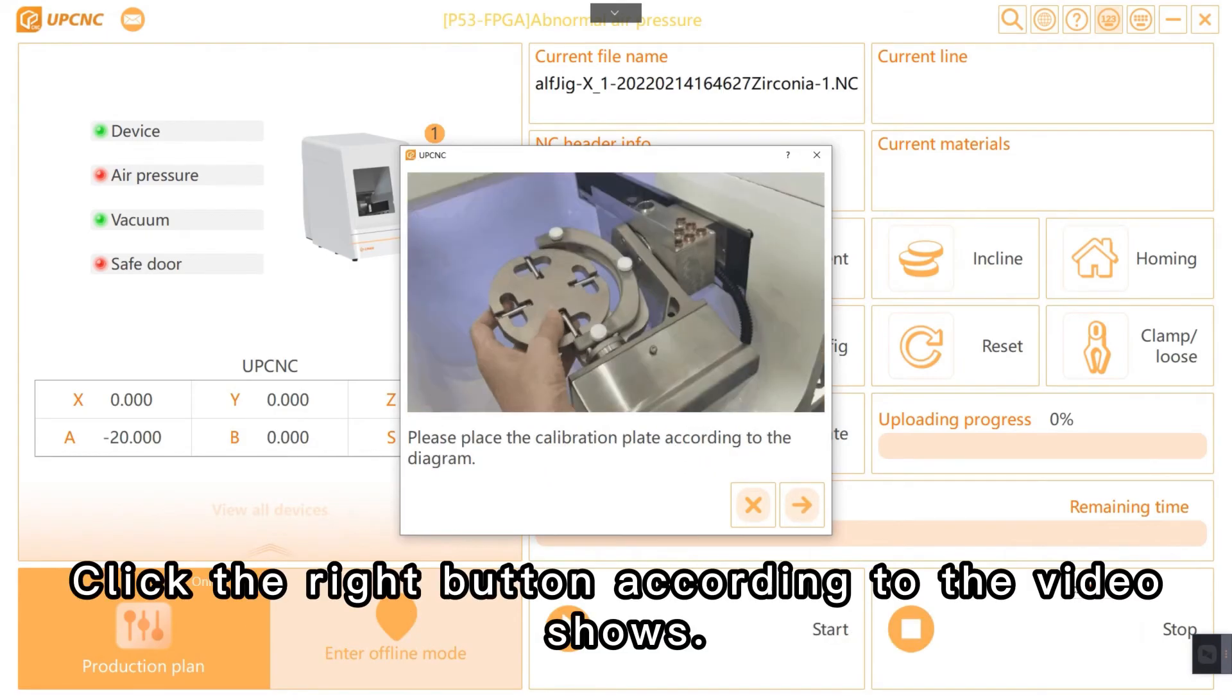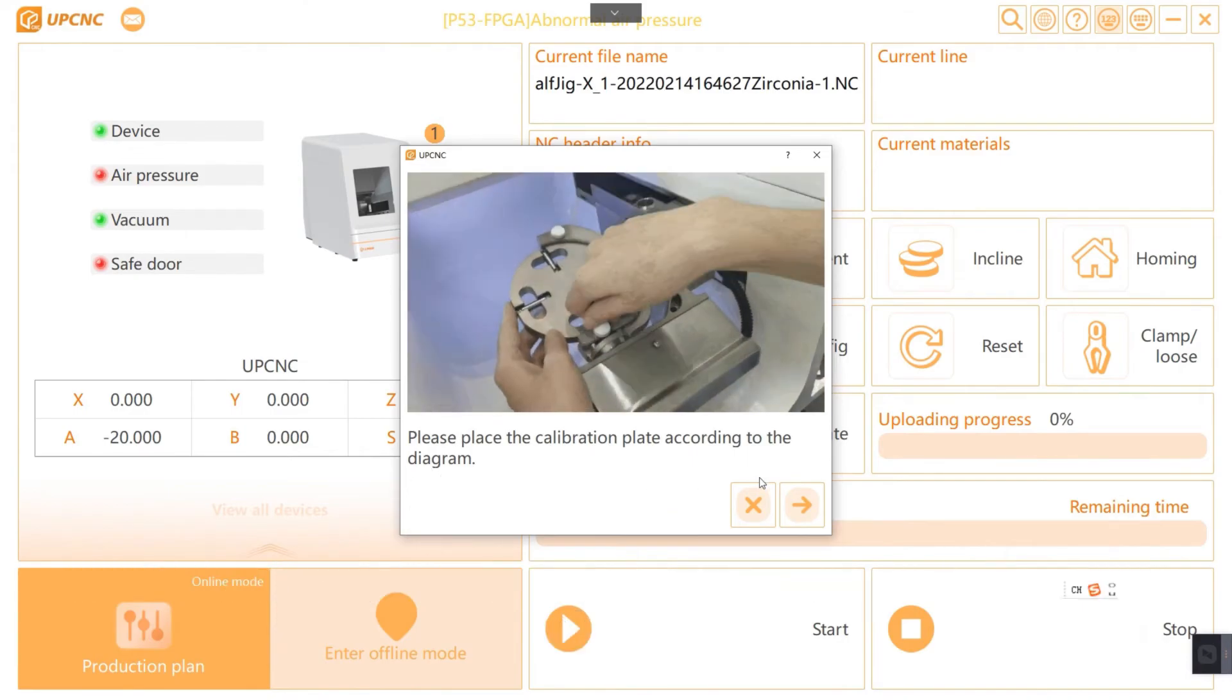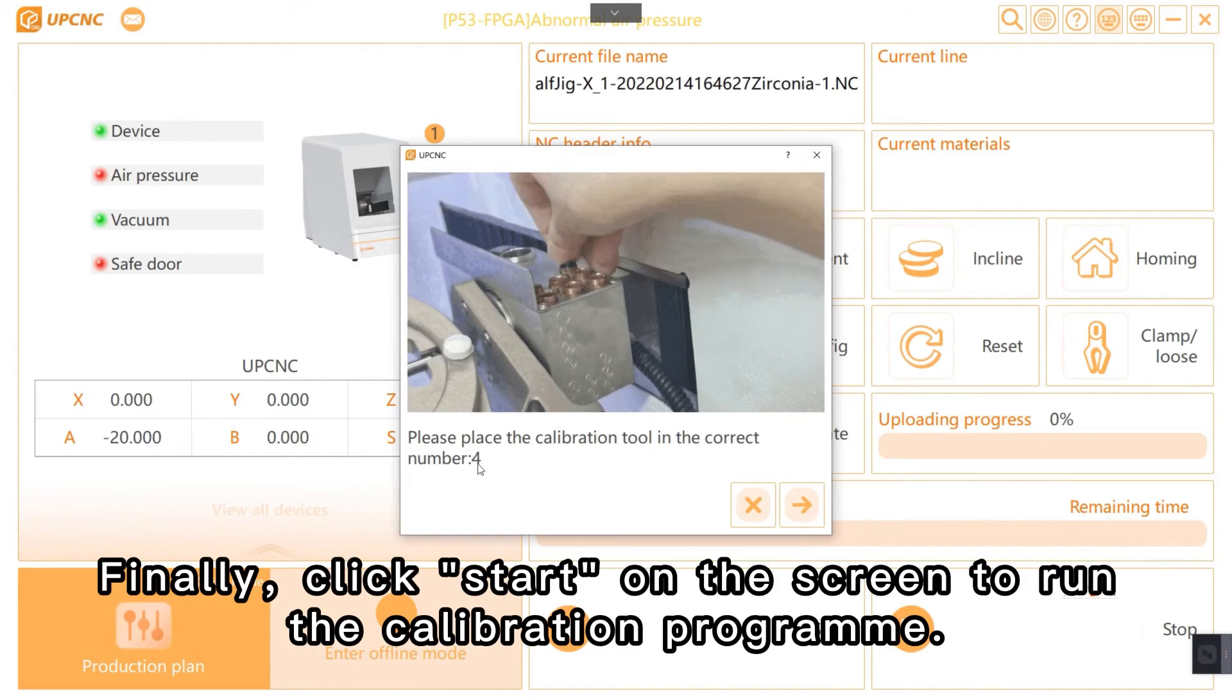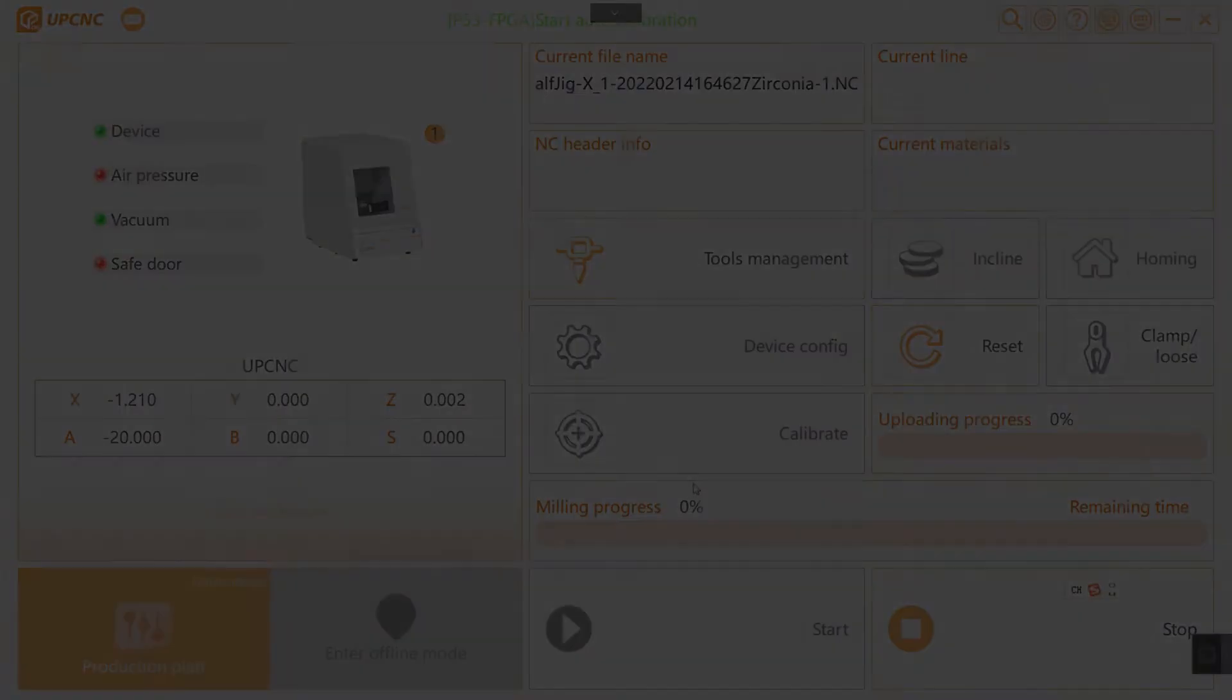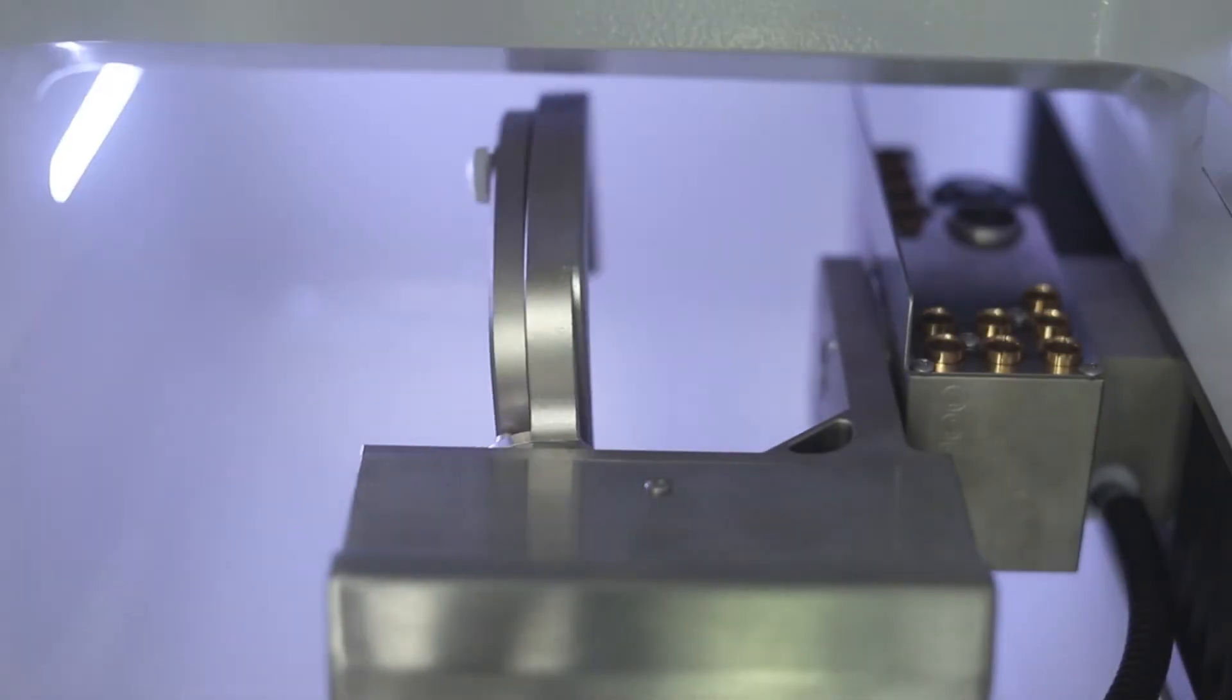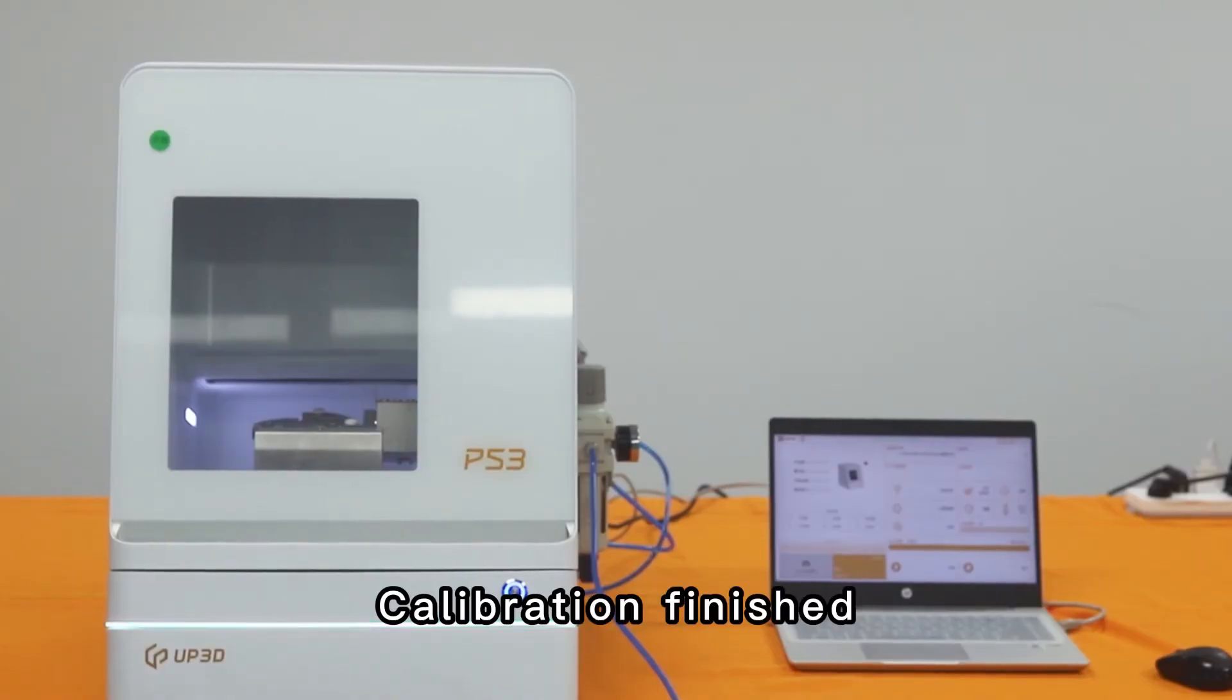Click the right button according to the video shows. Finally, click start on the screen to run the calibration program. Calibration finished.